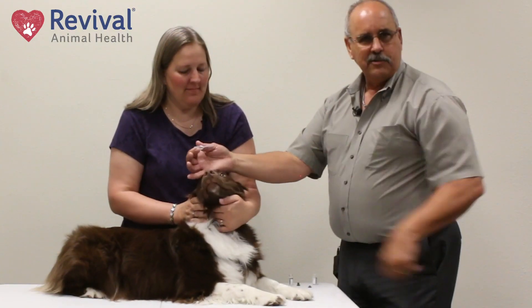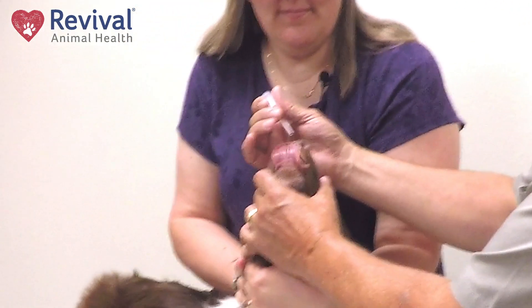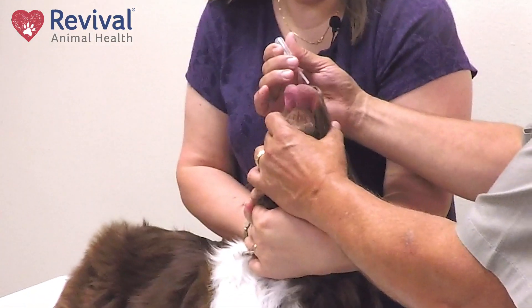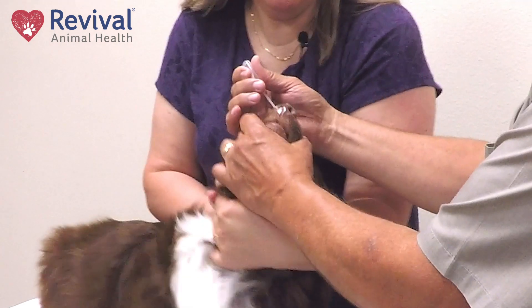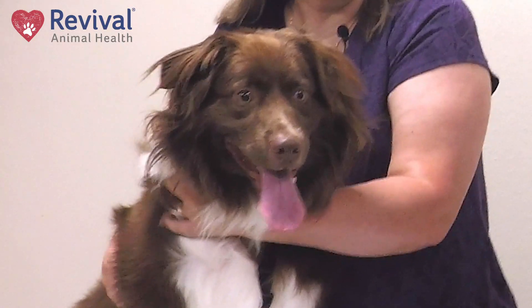If you have an anxious dog, what I love to do is give him a treat, show him another treat, put it in my pocket — then they think about it while I'm doing it. So he's up here trying to figure out what I have. I'm just dripping it onto the nose gently, and you can see he's pulling it in. He's a little uncomfortable but this is just fine. And now he's vaccinated safely and effectively.